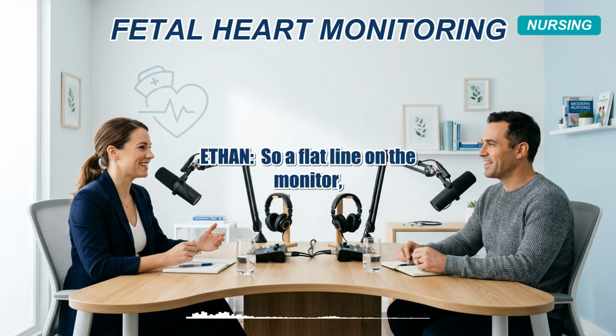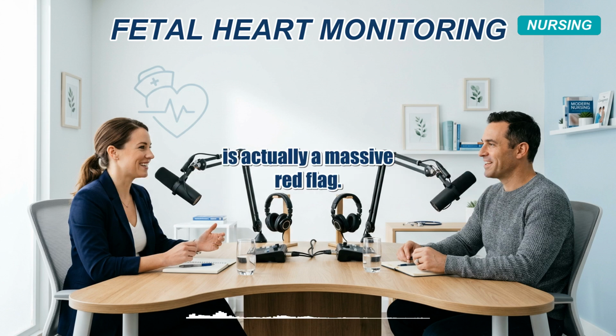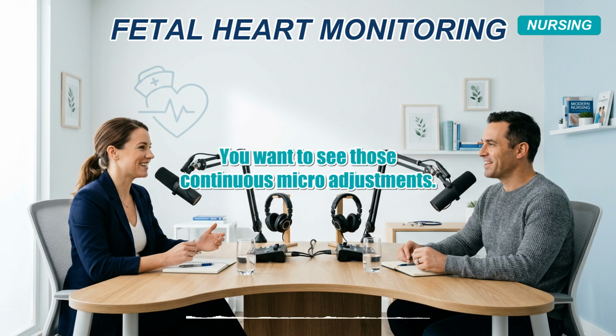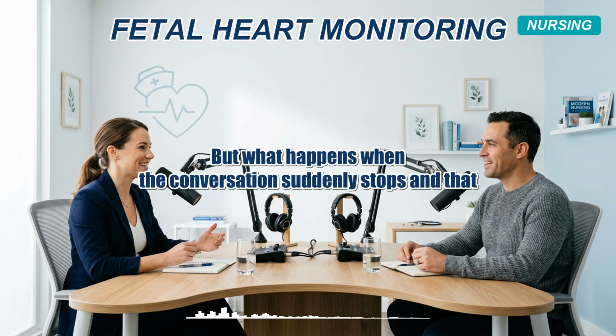So a flat line on the monitor, a completely quiet dinner party where nobody's reacting to anything, is actually a massive red flag. Absolutely. The wiggly line is your best real-time reassurance that the baby is doing well. You want to see those continuous micro-adjustments. Okay, so a wiggly line is a great dinner party. But what happens when the conversation suddenly stops and that heart rate drops?